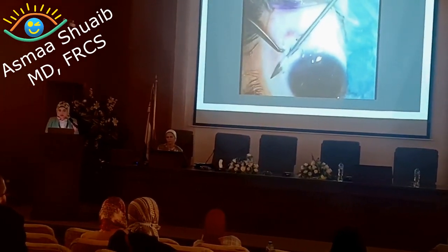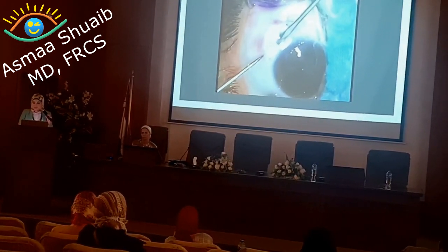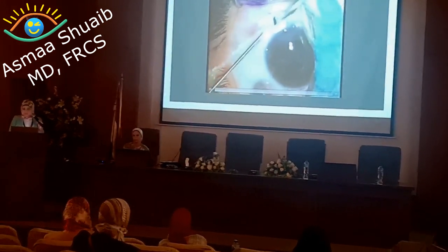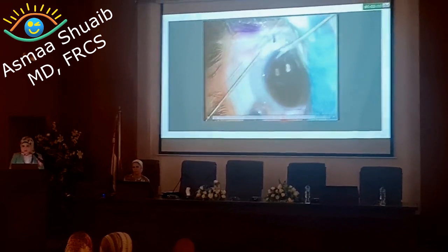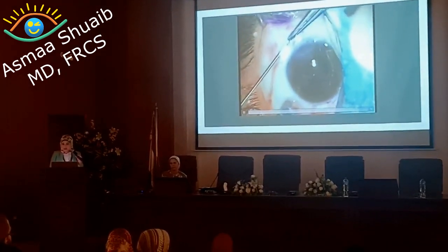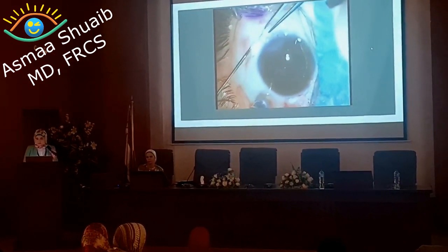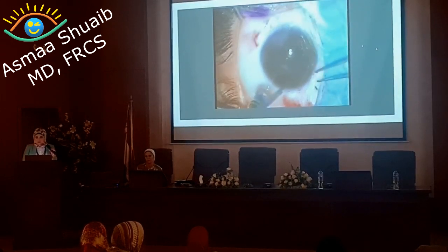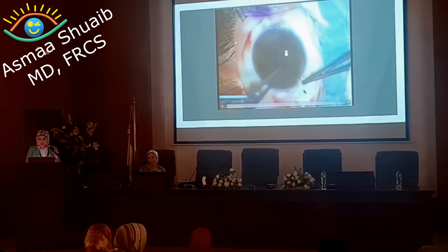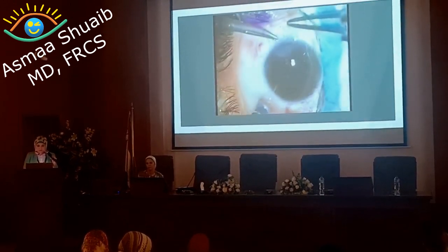Here we are fashioning the tunnel, and then the 23 gauge forceps is inserted into the tunnel to hold the haptic and pull it into this tunnel. And now we have the two haptics inside the tunnels, and the IOL is well centered in the eye.